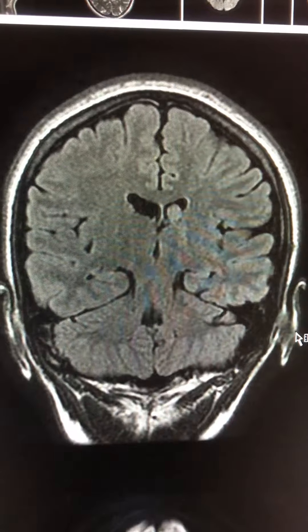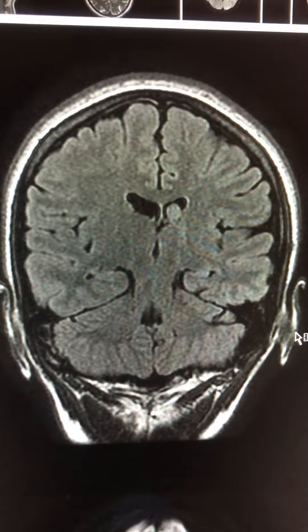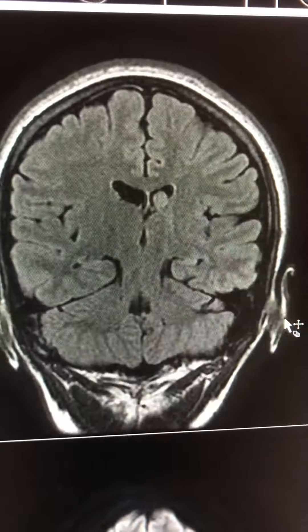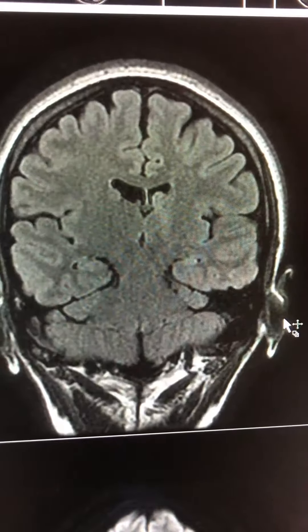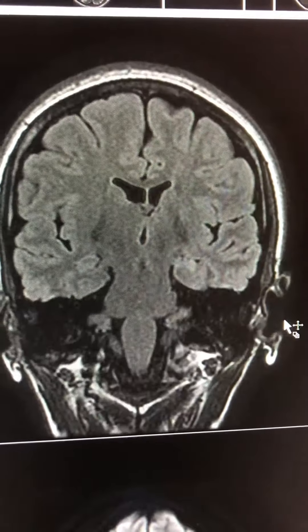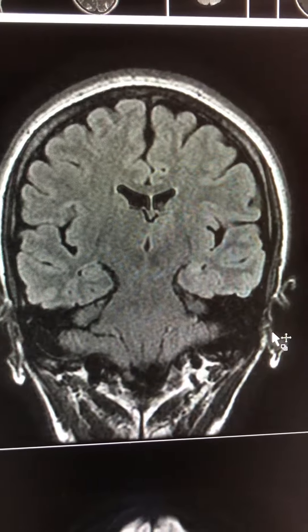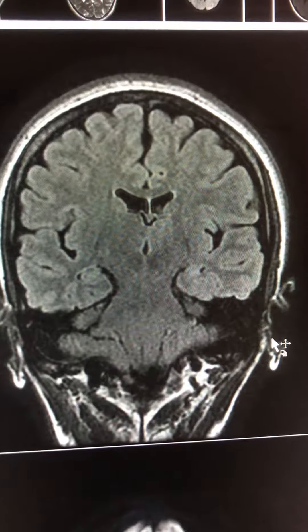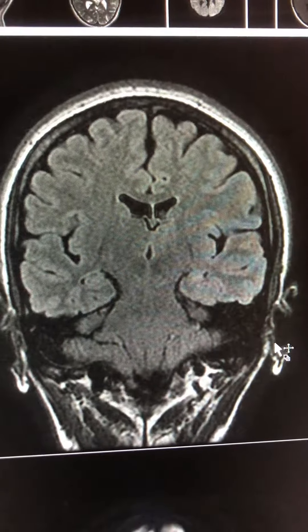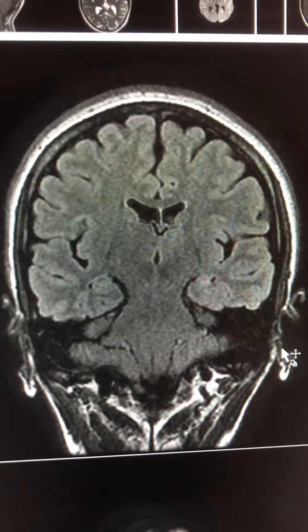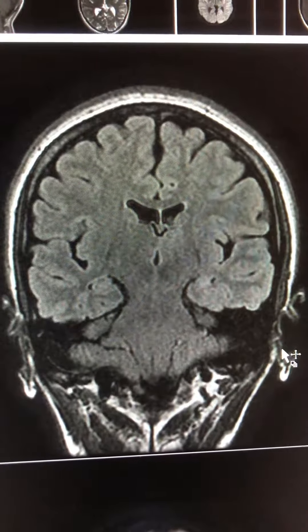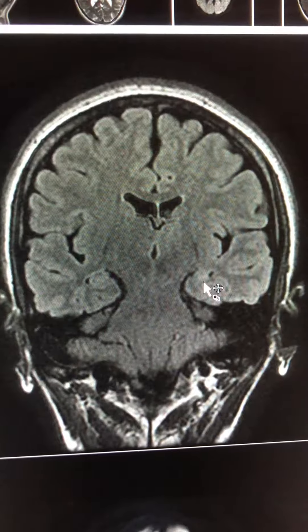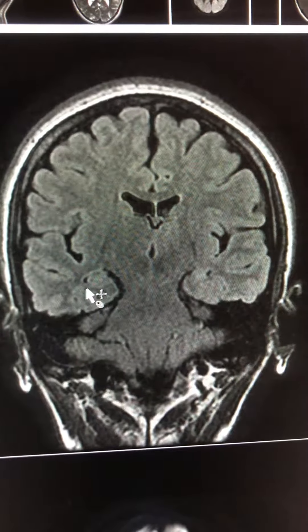This is somewhat of a typical case. You see a patient presenting with seizures, and if you compare, we usually do thin cuts through the hippocampal formation. We need to do FLAIR and T2, and we can compare the hippocampus on the left compared to the right.